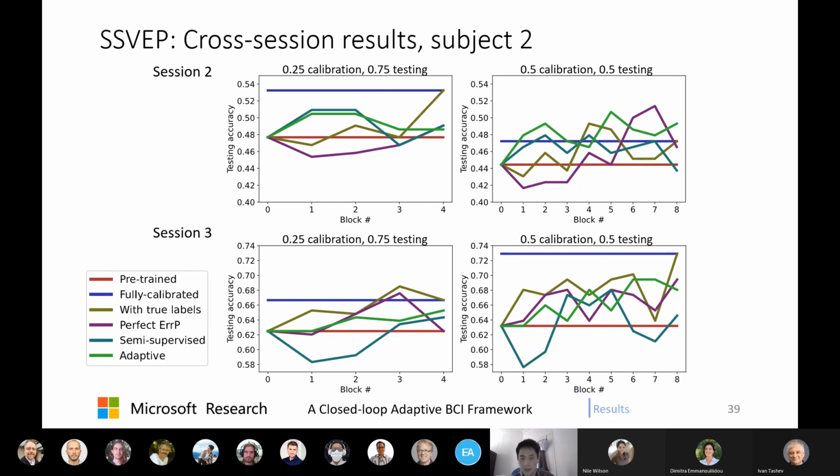For information, the EEG headset we use does not tell the impedance of the electrode, so I have to visually observe whether the signal quality is good enough. So when setting up on my roommate, I guess there's more variation when putting on the device.